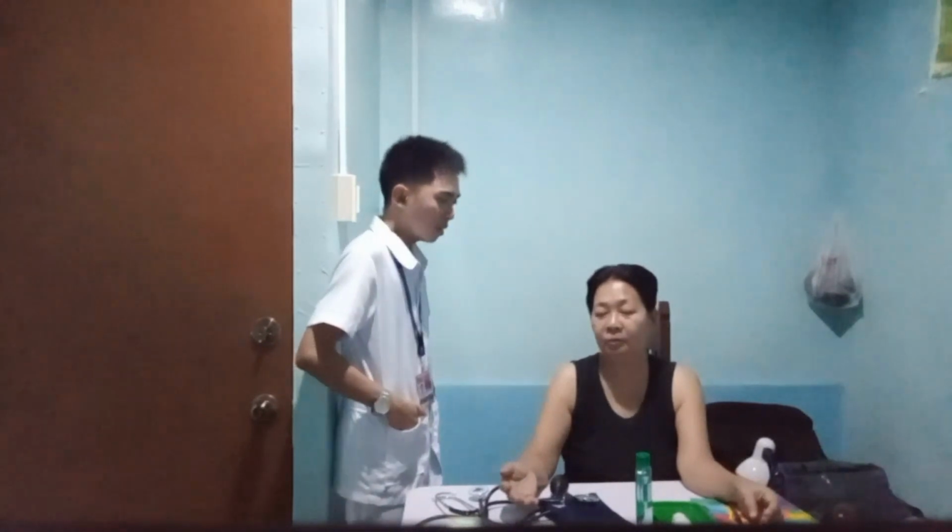To take blood pressure by the one-step method, first check the patient's baseline reading and document, of course, and determine the best site to use. Introduce yourself and identify the patient using the two identifiers. Hello ma'am, my name is Guadalquiver and I am your student nurse for today. May I know your name? Edna Huerte. When is your birthday? October 25, 1957. Okay ma'am, is it okay with you to take your blood pressure? Yes. Any concerns or questions, ma'am?